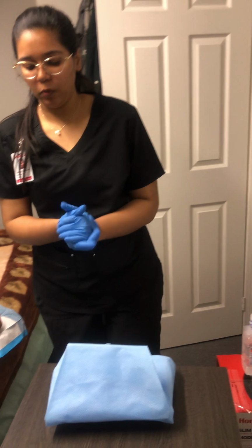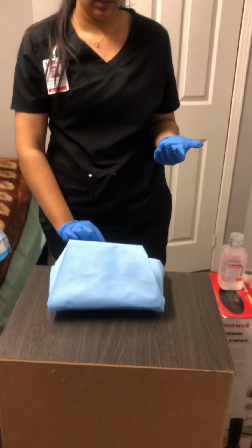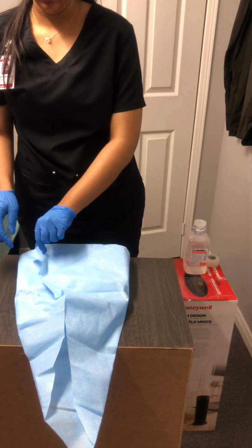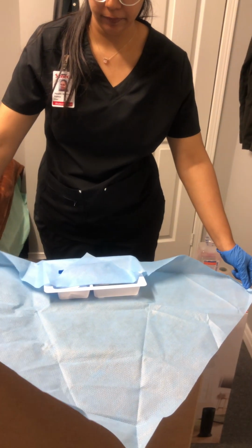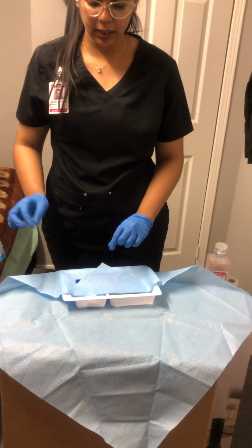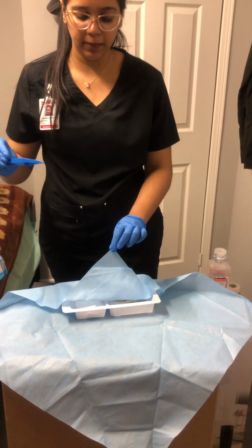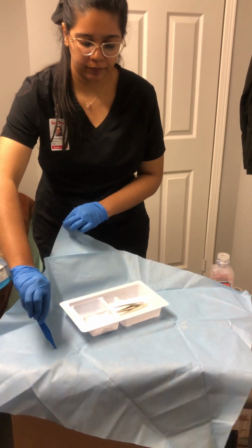And now we are going to create a sterile triangle. So we are going to open a sterile kit. Firstly, we will open the flap away from us, then to the left hand, then to the right hand. Make sure it touches nothing else. Pick up the flap towards you and pick up the forceps. And now we will reposition our kit.